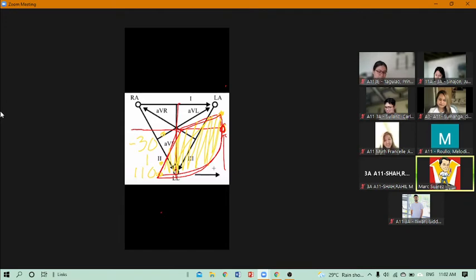One is the conference or the video loading, ECG tracing. So that is done, that is program outcome number one, clinical competence. Yes, Doc, I'm also on the ECG. Okay. So for this one, what activity was done?